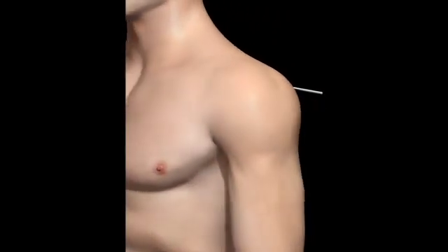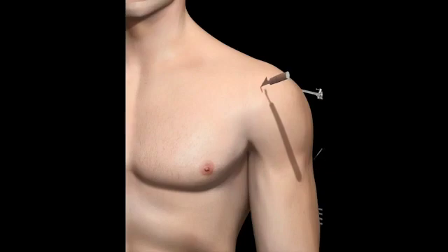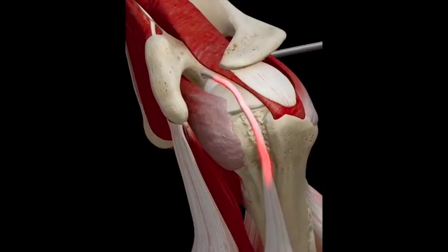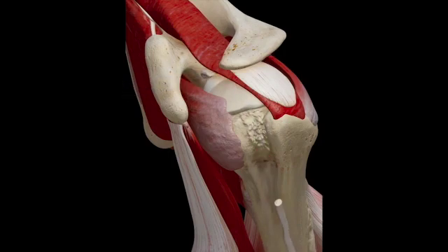A biceps tenotomy is a common treatment of biceps tendinitis, a condition in which the tendon becomes painful and inflamed. The treatment is via an arthroscopic procedure that involves making a cut to the tendon to release it from its attachment on the glenoid.